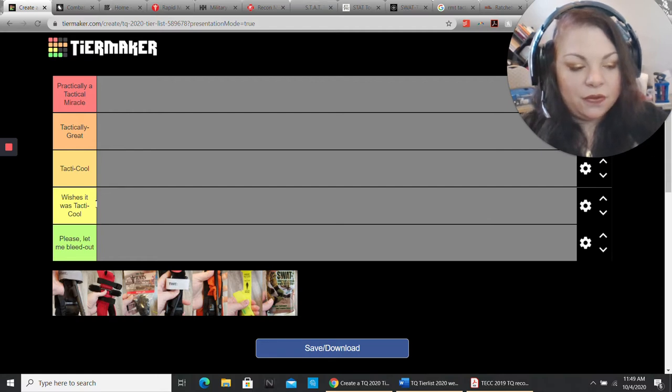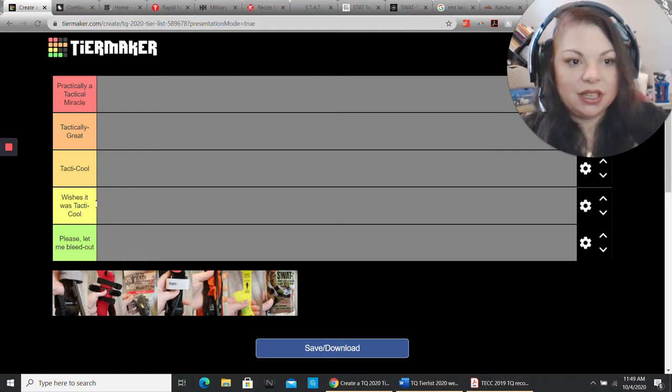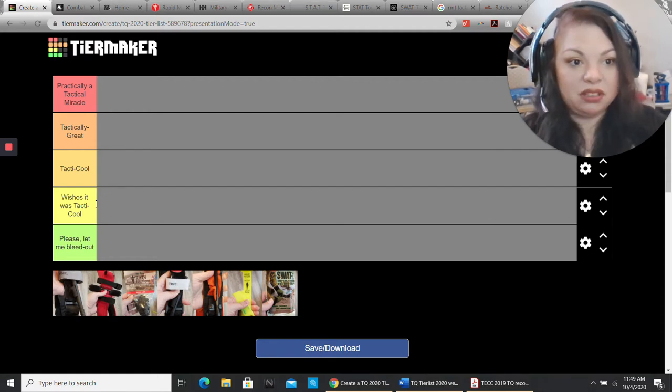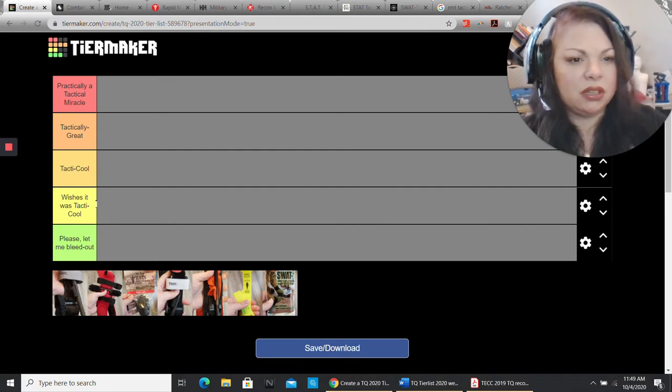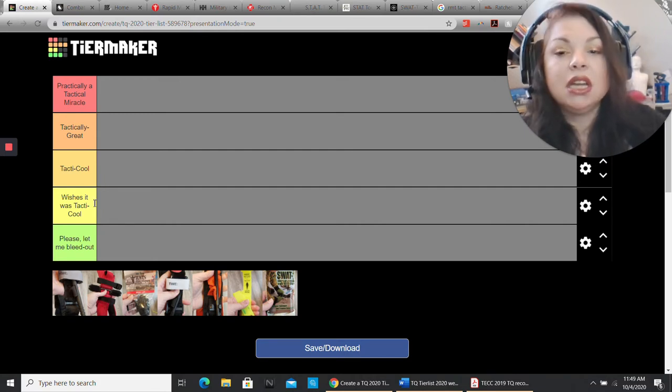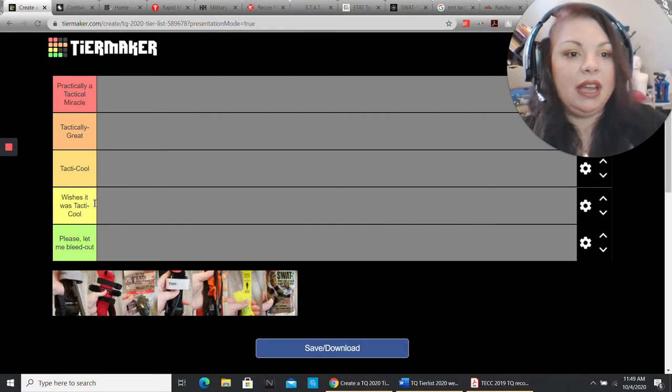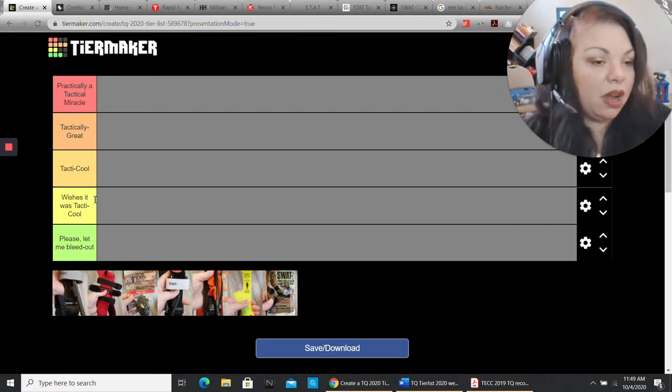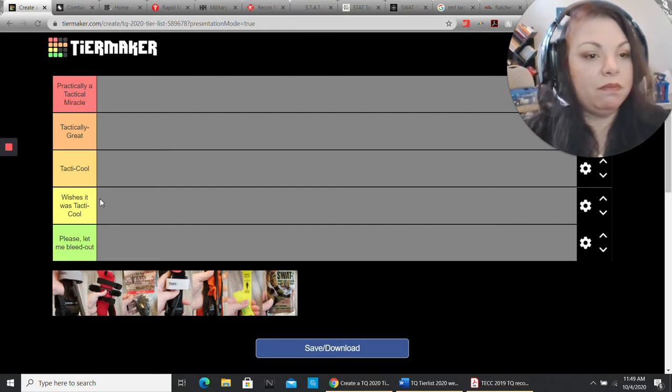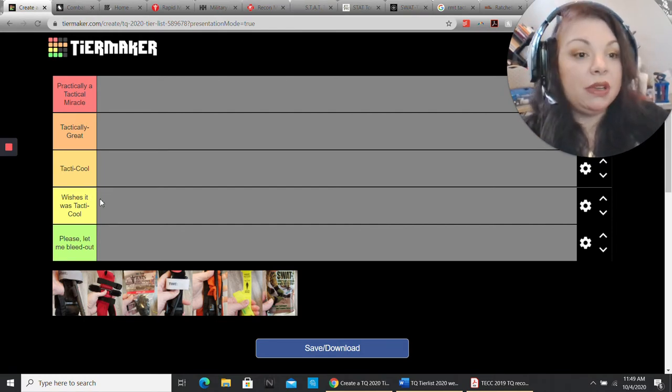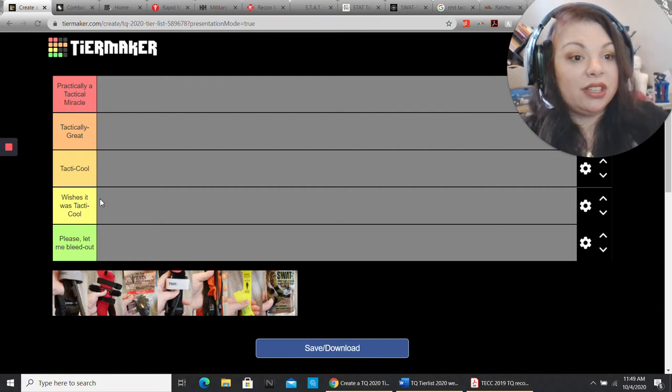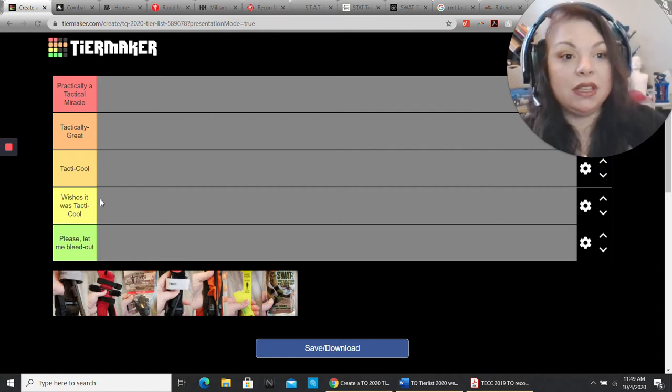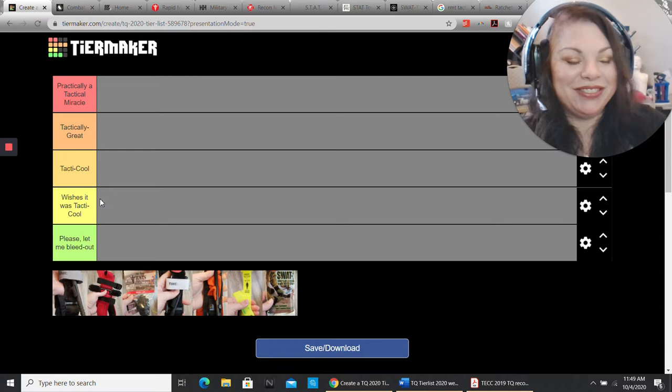Let's go into what criteria I use to determine where these tourniquets are going to place. I looked for efficacy. Did it work? Does it work? That's pretty important with a tourniquet. You want to stop your life-threatening bleeding. It would be really great if the tourniquet actually did that.